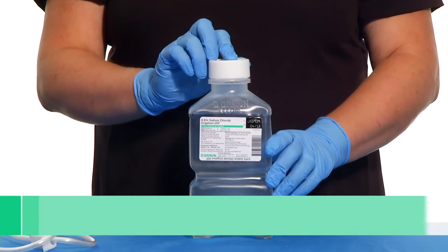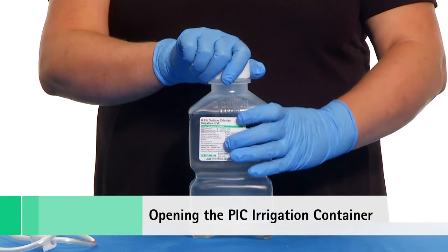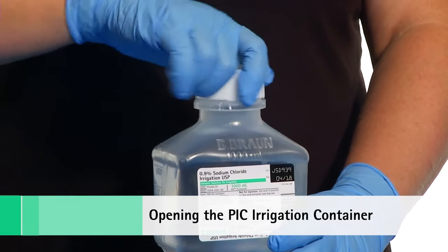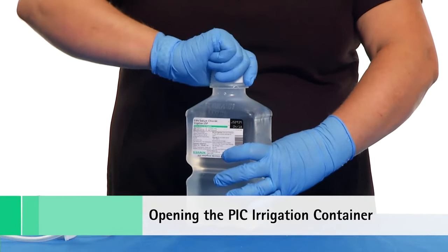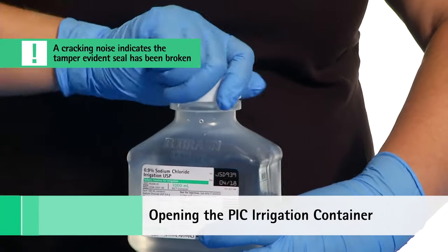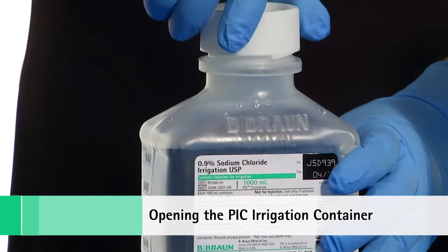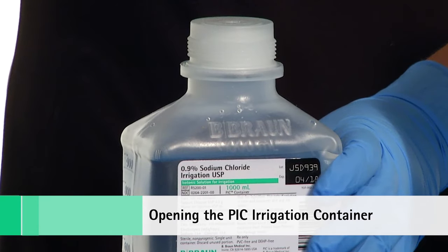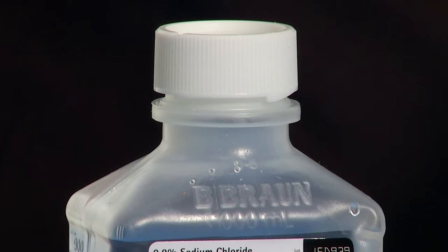To remove the tamper-evident outer seal, grasp the container with one hand and turn the breakaway ring counterclockwise with the other hand until resistance is felt. Then, twisting the container in the opposite direction, turn the breakaway ring sharply until the entire outer cap is loose and can be lifted off. If after twisting you are left holding an open ring, you have turned the breakaway ring in the wrong direction. Re-apply the ring by twisting counterclockwise and open as usual.